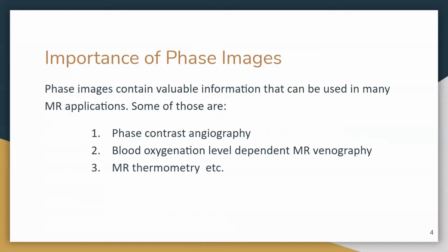And the paper also tells us the importance of phase images. Phase images contain valuable information that can be used in many MR applications. Some of those are phase contrast angiography, blood oxygenation level dependent MR venography, MR thermometry, etc.